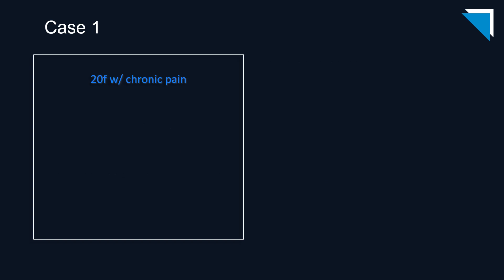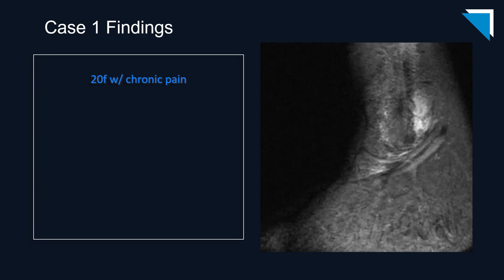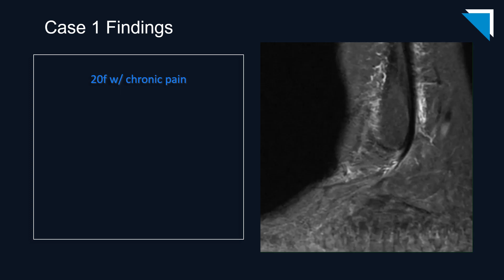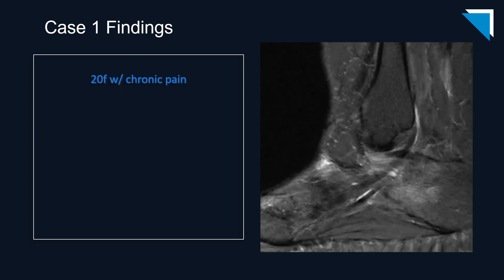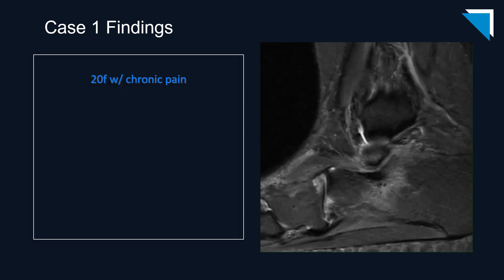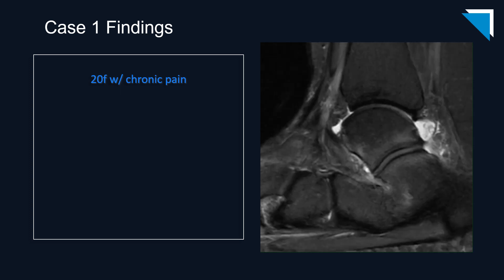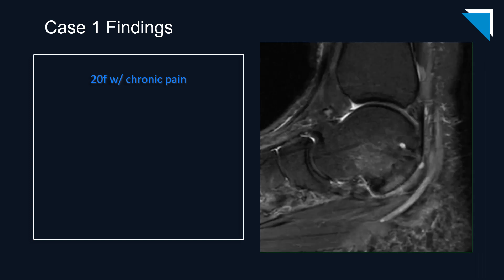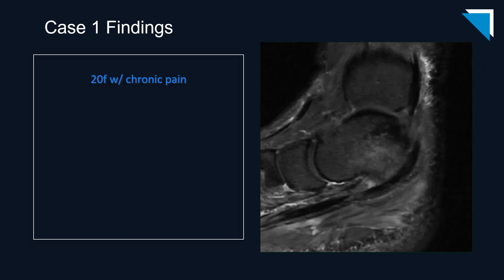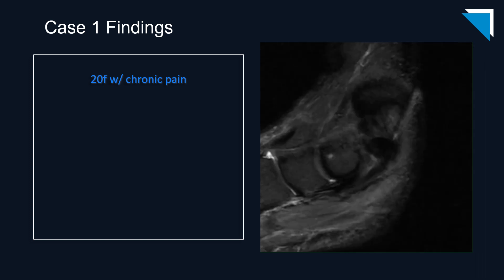Our first patient is a 20-year-old woman with chronic pain. Let's begin by scrolling through the sagittal images from an MRI of an ankle. This is a fluid-sensitive sequence. You can see the ankle joint effusion.